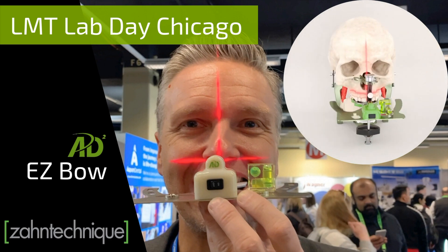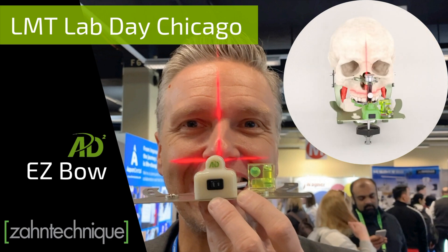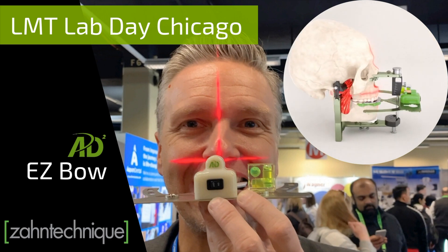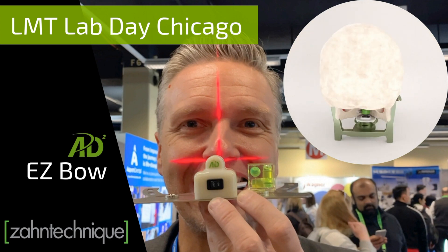Hi, it's Alex from zahntechnique. I'm so excited to showcase some of the hottest innovations at the LMT Lab Day in Chicago. We all know the problem when a face bow was used and the positioning can be quite tricky. Watch this video to see AD2's solution for this.